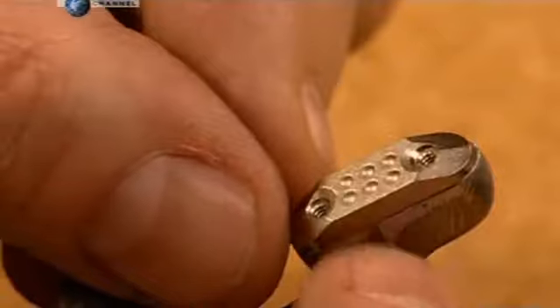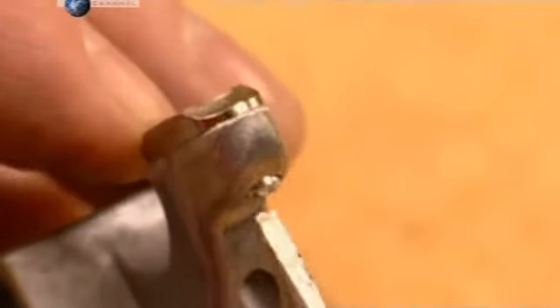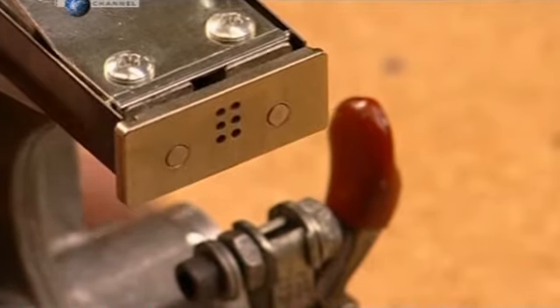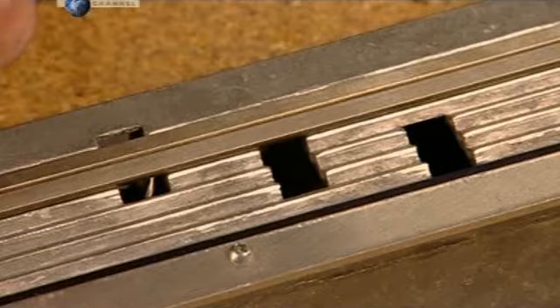The die is screwed to the carriage top, but not yet installed in the machine. This is how the carriage and die will meet once it's in place. Construction of the components which move the various styli begins.